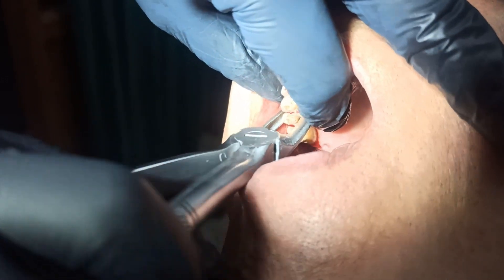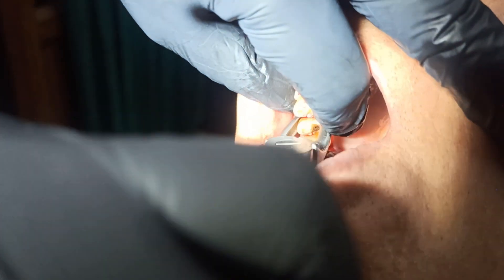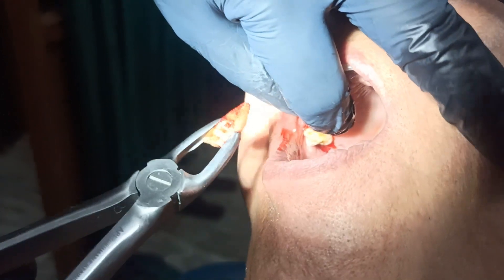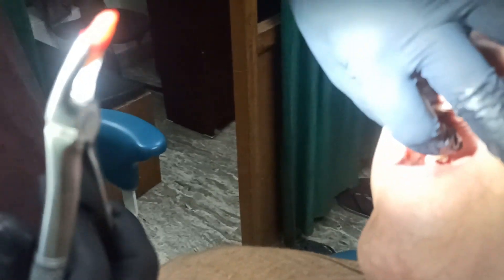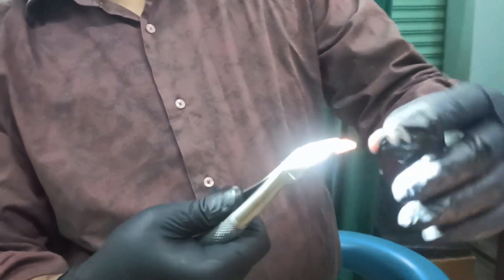Pressure is out of here. The root is out of here, no fracture, the root is out of here.